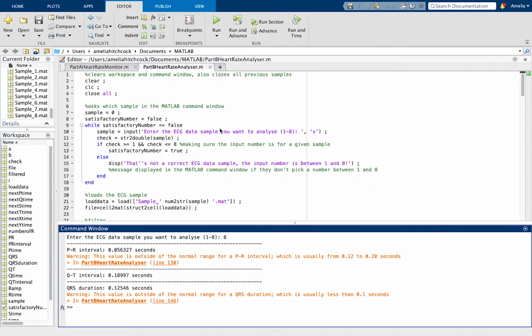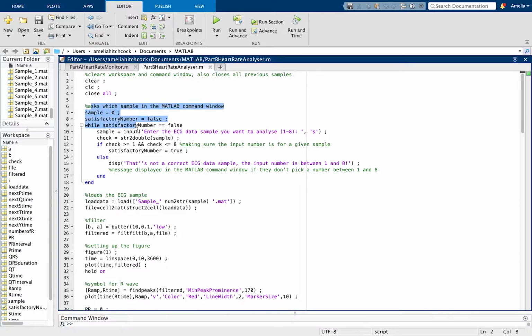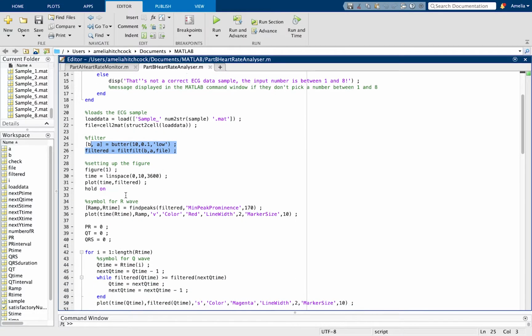And this is the last sample right here. Okay, now I'll take you through the code. So first of all, it clears everything. Then it asks which sample you want. It loads that sample. I use the same filter as the last project.